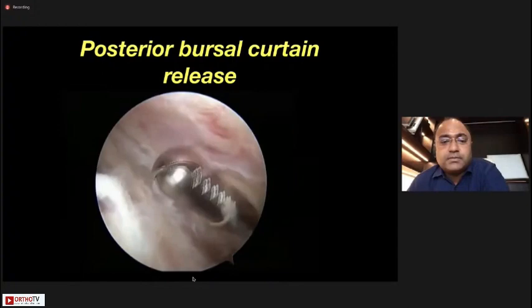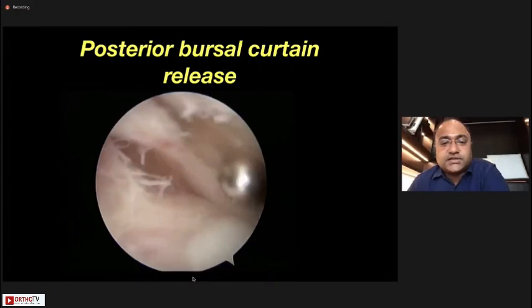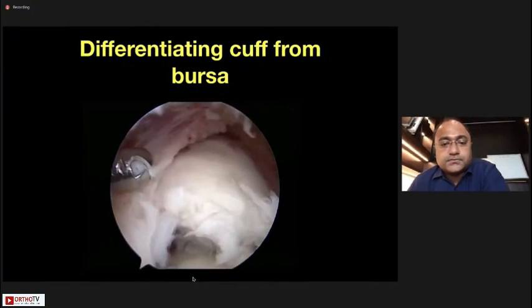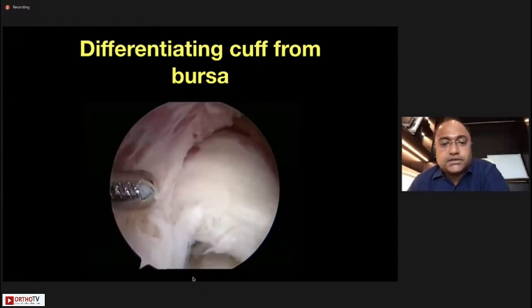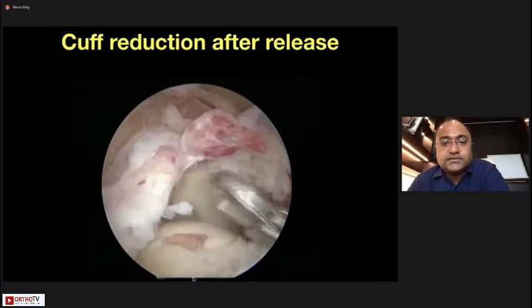This can be intimidating for young surgeons — knowing what is bursa and what is cuff. The trick is to rotate the arm: what moves is the rotator cuff; what doesn't move is the bursa. Once you are sure which is which, you do need to perform the posterior bursal curtain release, otherwise you will not have a cuff repair.